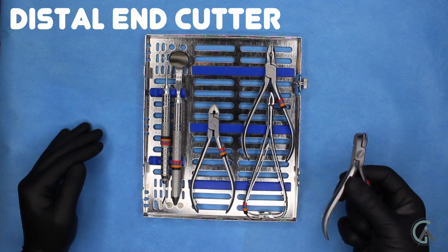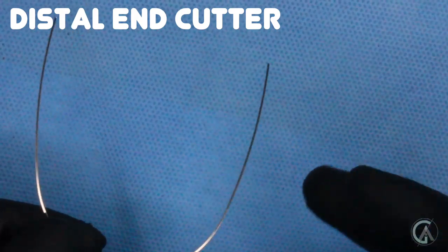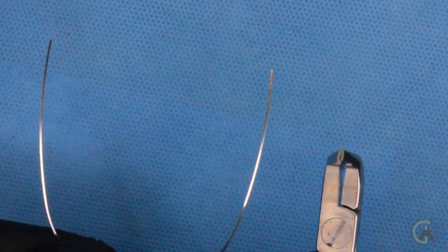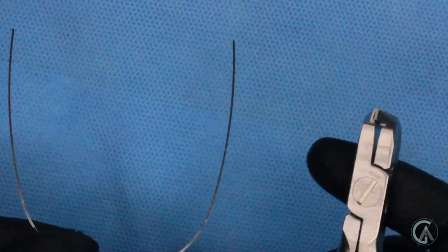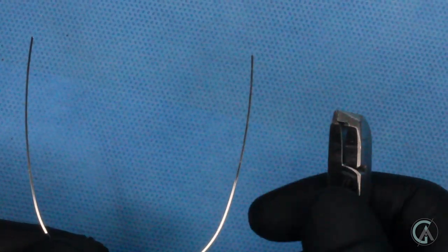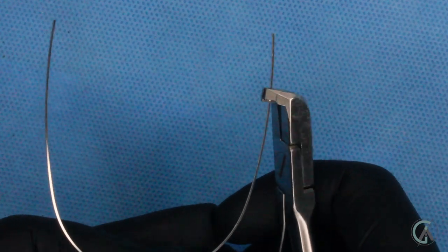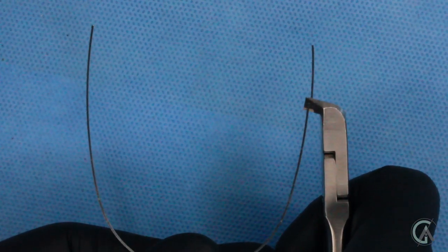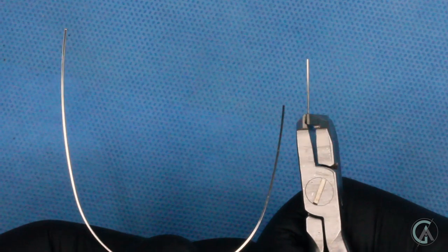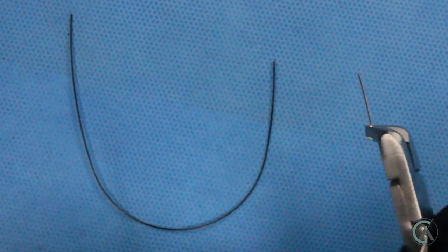Next let's look at a distal end cutter. Distal end cutters are pretty awesome instruments — what they're used for is to cut wires to the right lengths. Your orthodontist might cut the wire before putting it in your mouth and then maybe do it again if it's a little too long. They're really neat because they have a part of the plier that holds the wire so when you clip it, it doesn't go shooting — it holds onto it while it's cutting. So if we were to cut this wire right here, you would basically hold it and squeeze, and this part of the instrument holds the wire so it doesn't shoot down your throat or fly across the office.